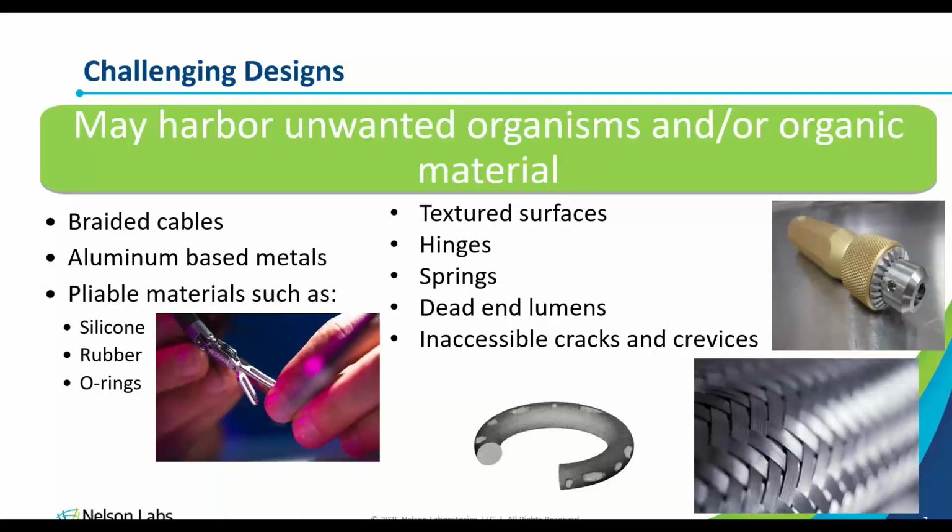Again, it's not necessarily about avoiding these designs, because these designs are here to help make your device usable. It's that if you need to use a spring, or a hinge, or textured surfaces like knurling, you want to design your device in a way that will allow for effective reprocessing. And really that thought process starts during the initial design of the device.